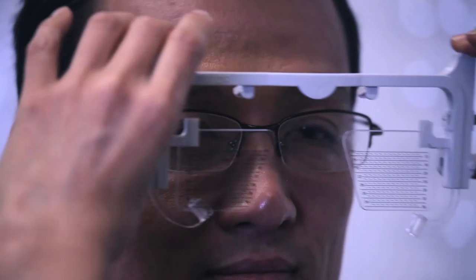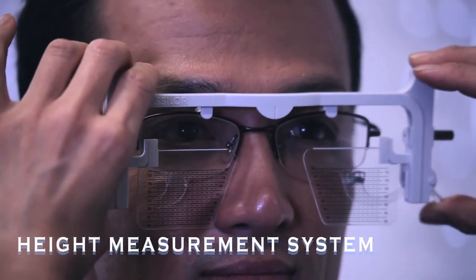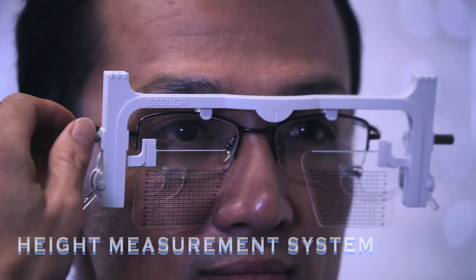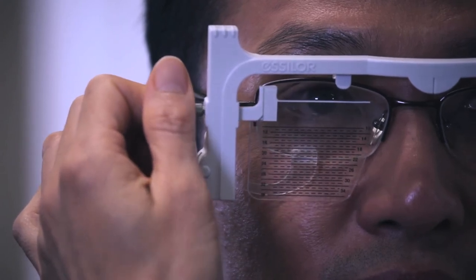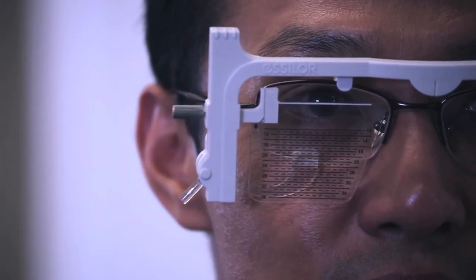A third method involves a gauge called the height measurement system. This gauge clips onto the frame and the scales can be wound up and down until the top of the scale is in line with the reference point, which in the case of progressives is the center of the pupil.